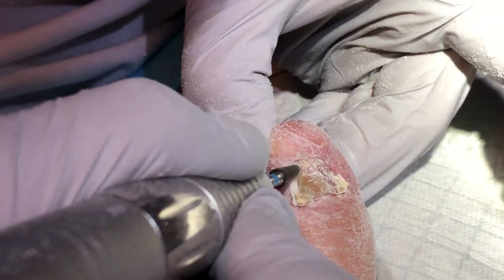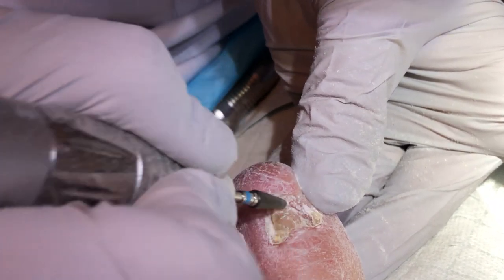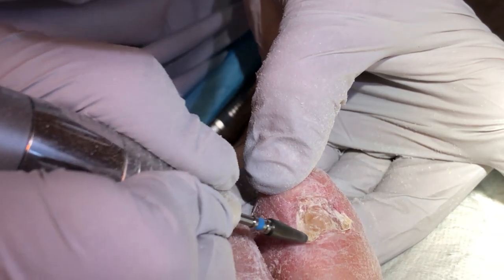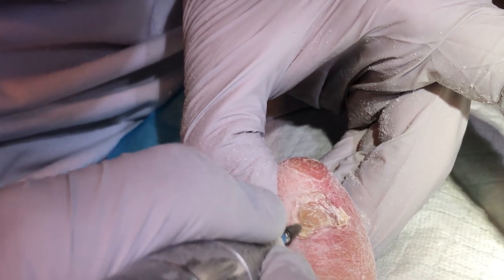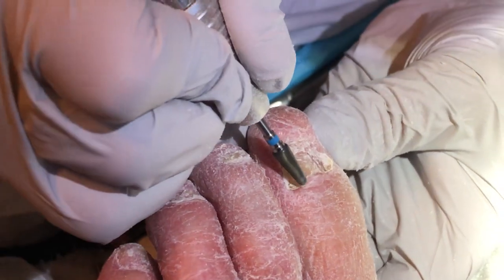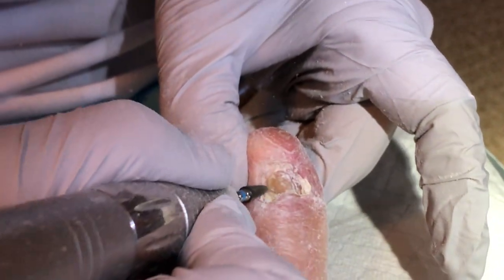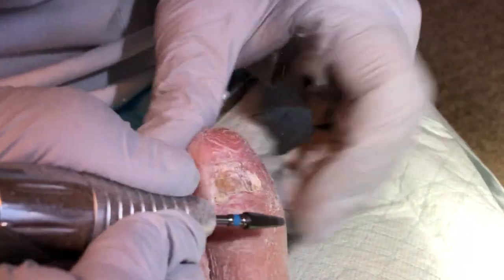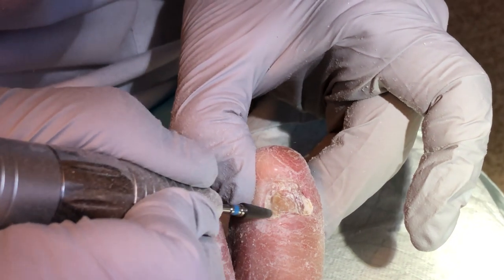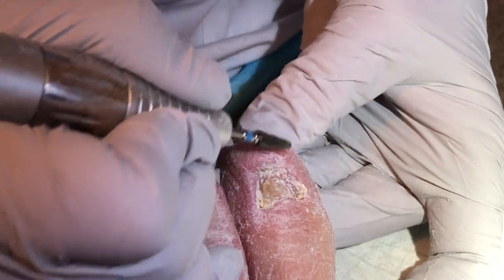How come you can't shave the big one down more? Well, I can, but there's live tissue — you see that? I just go until it starts getting a little pinker and I know there's going to be live tissue. There are different levels with these fungal nails; nothing is normal. So I can't ever really get anything flat and I just kind of work on it bit by bit, and get it as smooth as I can. I can't just go because this is all live underneath here. That's the skill — knowing when to stop. And sometimes you learn that by going too far and causing them to bleed, and it happens. But I'm going to stop there.